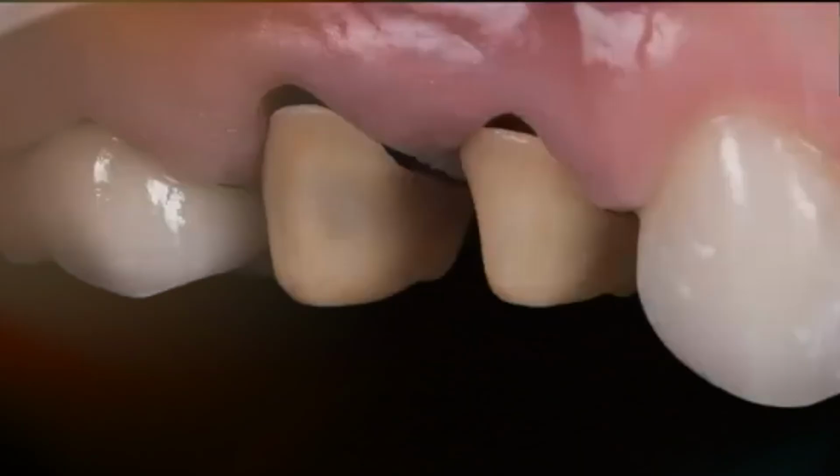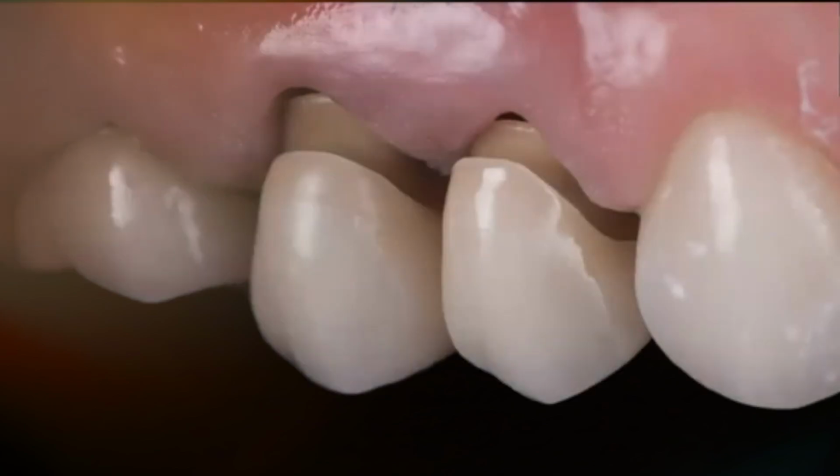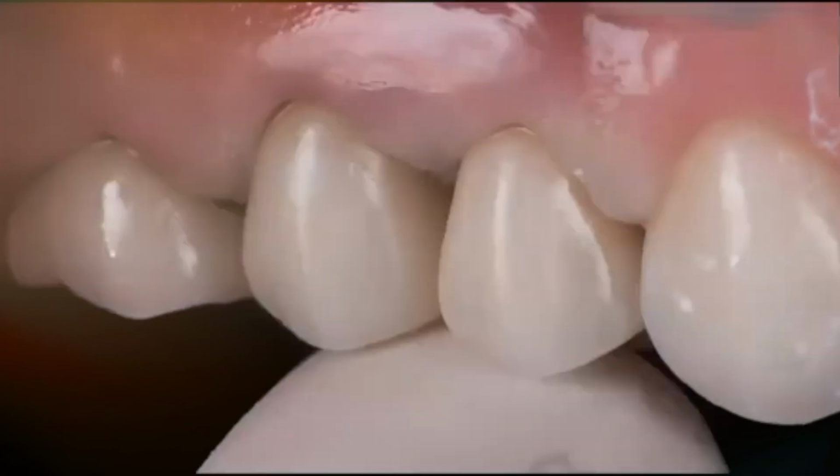So in this type of case where you have dark teeth, you have, for example, here zirconia. Actually, I don't remember in this case if it's zirconia or Emax, but either way, it's stained to get more chroma because otherwise you will have a problem blocking the white. Then you have the ceramic crown on top, and then you can block it very nicely.